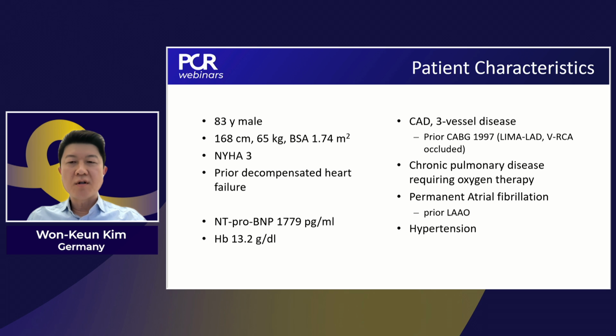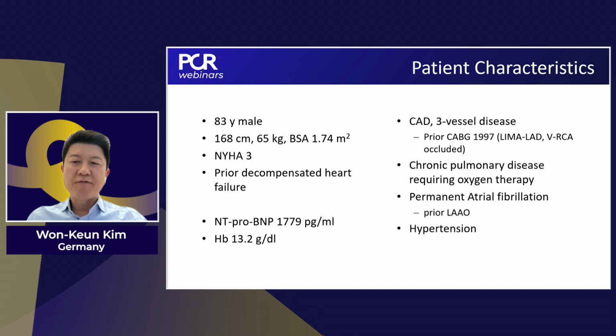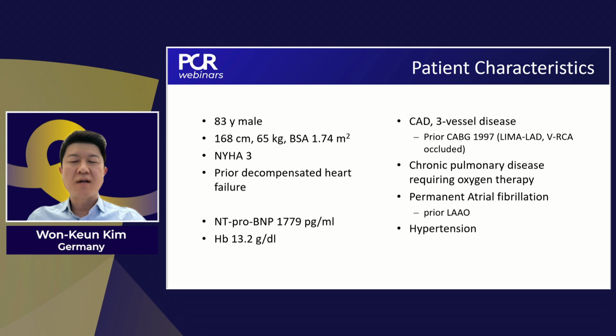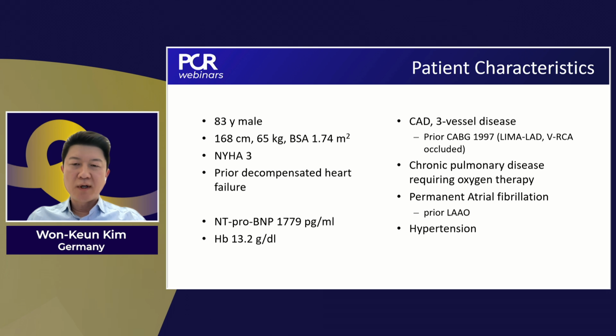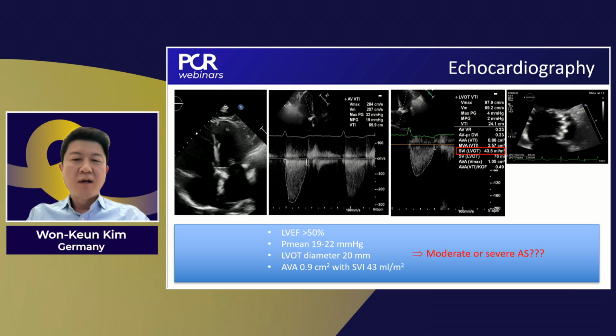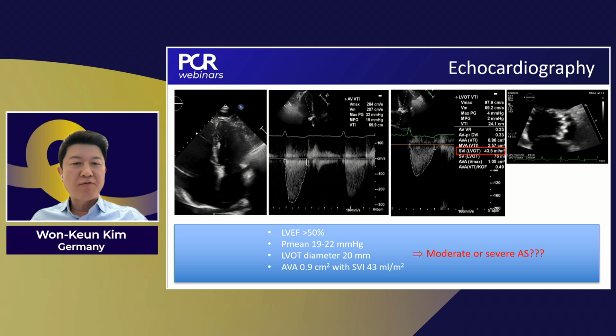So I think it's important not only to look at the comorbidities in terms of risk classification, but also to look at competing causes of shortness of breath, especially in relation to the topic that we have. Because what we have to find out now, and you can see in the following slide, the echocardiography, TTE, and you may appreciate that the ejection fraction is more or less preserved.